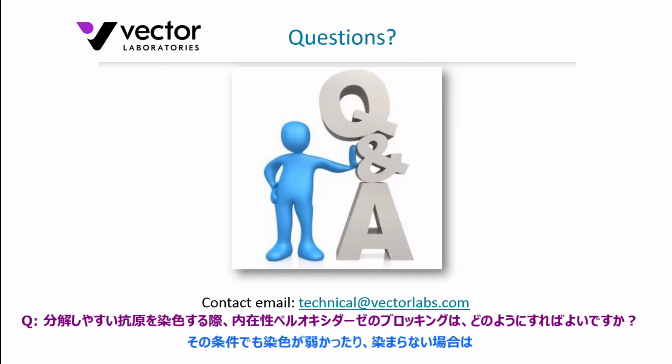You could try that. If you do see a diminution in staining there or a lack of staining, you could try one of the alternative methods we've described here in a couple of those publications I showed earlier on. Alternatively, you could consider using a different enzyme-based system, such as alkaline phosphatase, so you don't have to quench endogenous peroxidase.